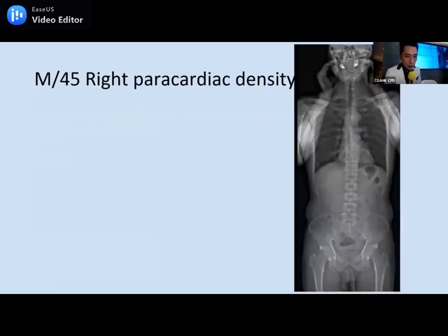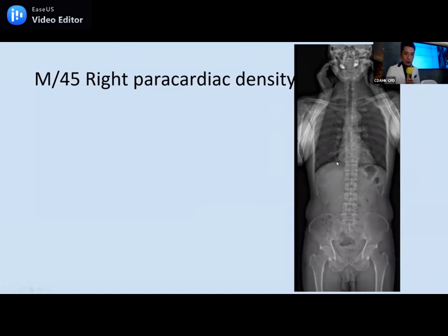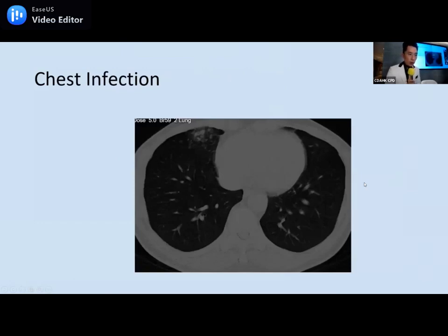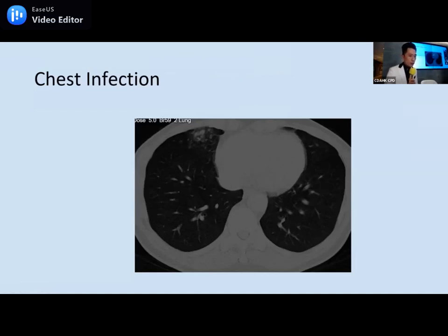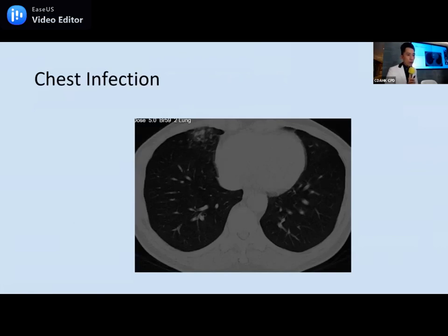Next case: another EOS showing paracardiac opacity over the right lower zone — very subtle, but with some additional density. On CT, there is haziness over the right lower zone: this is a case of chest infection. We should give the patient antibiotics and follow-up low-dose CT to see if there's resolution. If there's clear resolution, it's just chest infection; if it persists, it could be something else, such as tumor. This illustrates the importance of following up the patient radiologically to confirm resolution.